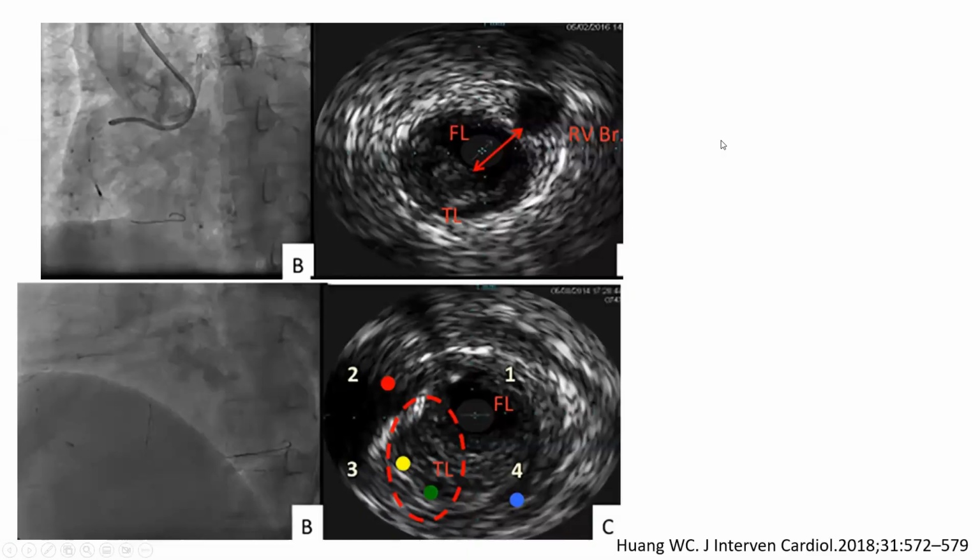You will be on this side with a collapsed white atheroma. These are images of CTO subintimal crossing. So here, the wire went subintimally, and the IVUS is over that wire. So the IVUS is in the false lumen, FL, and the true lumen is that white compressed intima atheroma.